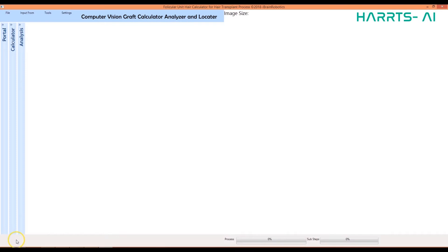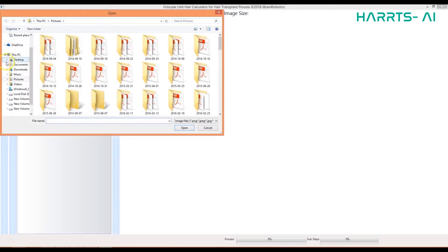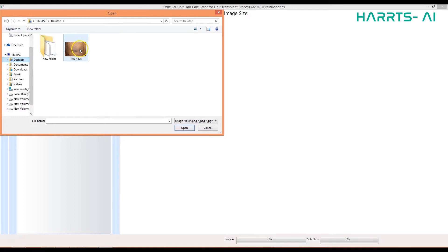Three steps in the HARRTS AI Graft Calculator: the portal, the calculator, and the analyzer. The portal: first, upload the donor area image into the portal. You can either upload an image from the system or use the system camera to get the image in the portal.